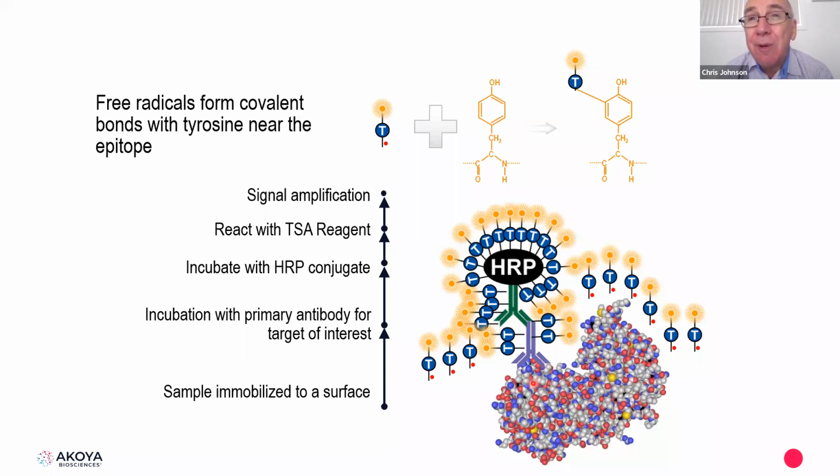Now, the reason why I say that, and to be fair, the ones that are in inForm are actually quite good, really quite well developed. But the tissue itself influences the spectral position. So if the tissue is old, for instance, say you're taking a block that might be 10, 15 years old, sitting there in the block, it's had some formalin still left in there because you just can't remove it.